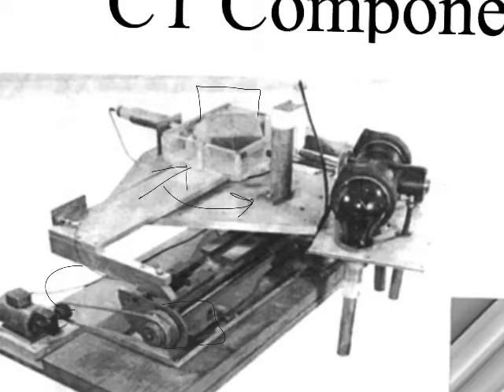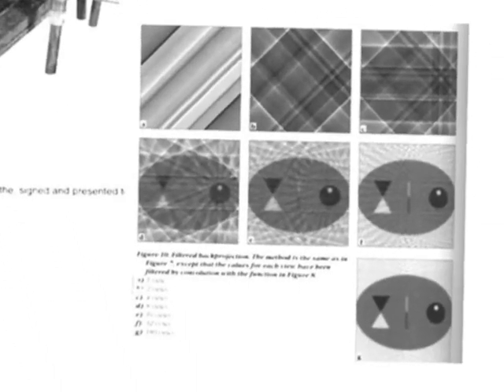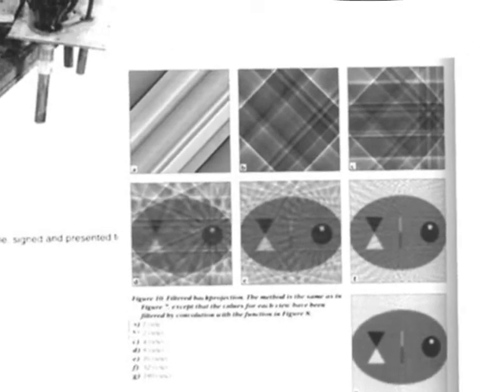And then, but he did have a way of detecting it. And so here's that detector over here. And it literally was just detecting one thing at a time. So it's not a very efficient process. But what was significant about this is not this weird, terrifying looking machine, right? But what's interesting about this is what he did with what we will call the raw data, right? So let's get over here and talk about this stuff.